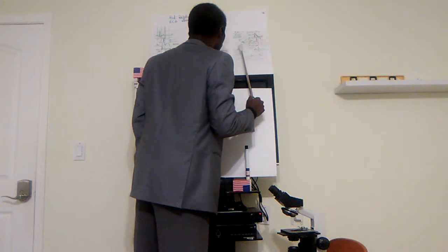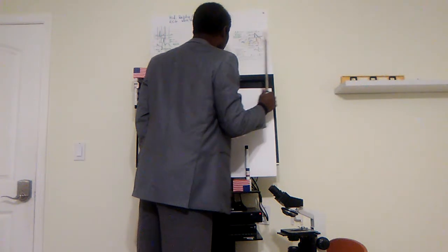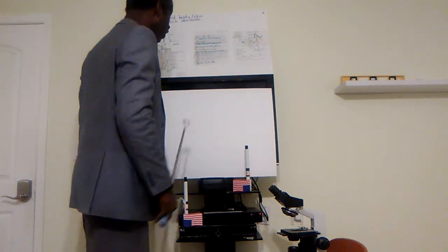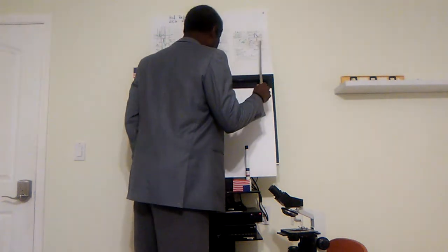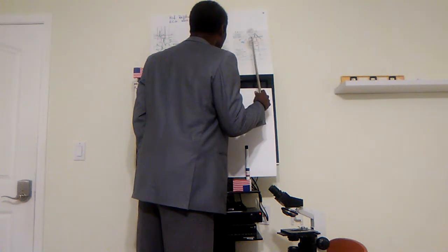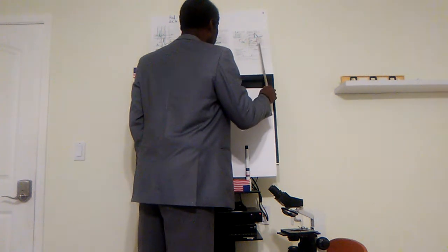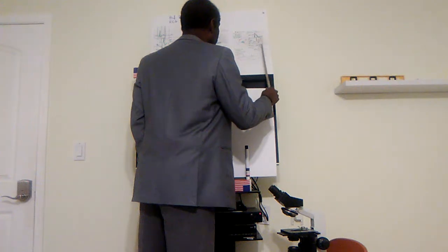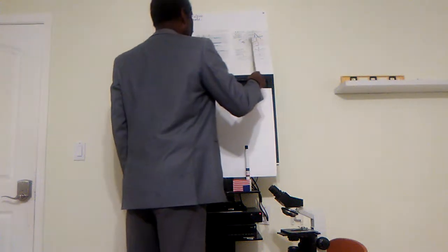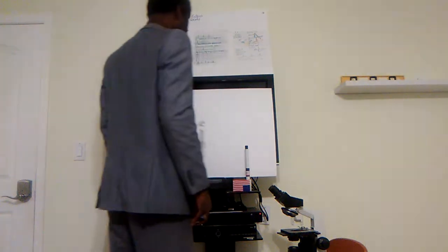And the sixth, we have the Purkinje fiber, and this is the sixth signal here. And remember now, the U wave is said to be generated by the repolarization from this Purkinje fiber. And the seventh and eighth are the ventricular muscles. These last two signals are from the ventricular muscles. And this is the diagram of the heart and the corresponding points in the heart and the corresponding signals from the ECG generated at these various points.